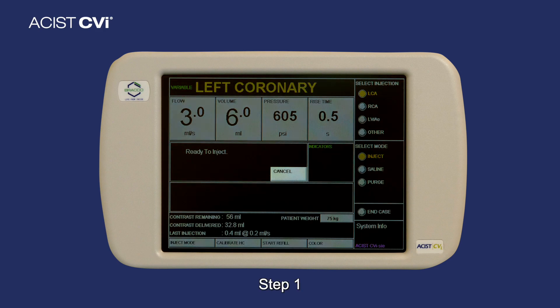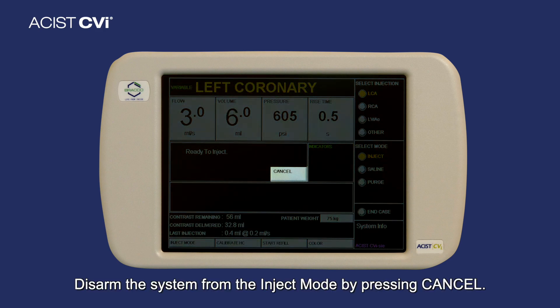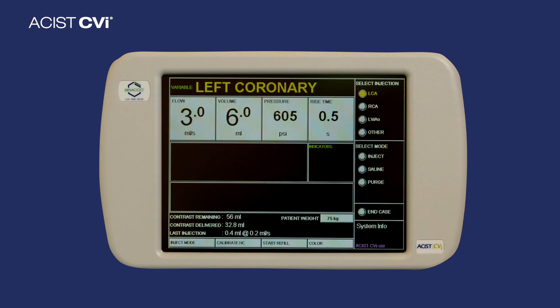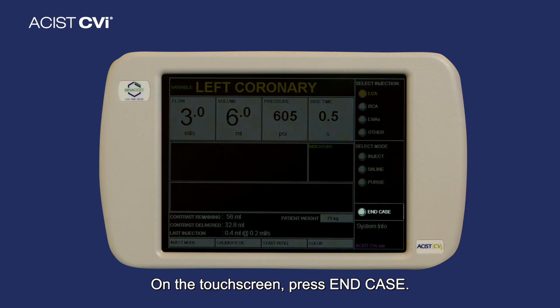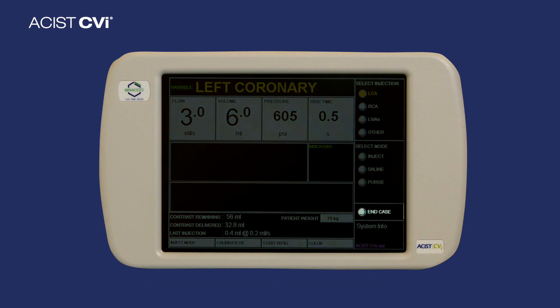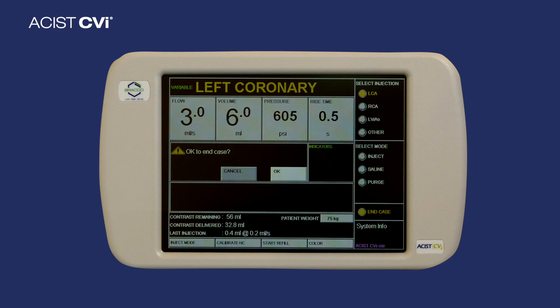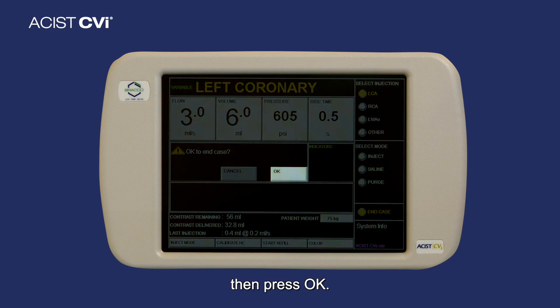Step 1: disarm the system from inject mode by pressing Cancel. Step 2: on the touchscreen, press End Case, then press OK.